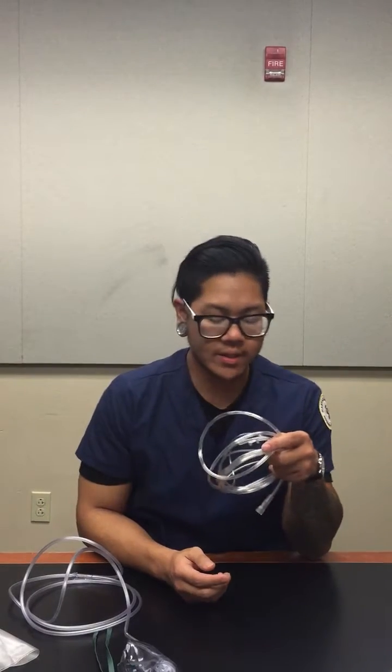The advantages for a nasal cannula are that you can use it on adults, children, and infants, and it's easy and cheap to use. The disadvantages are that it's uncomfortable, it's unstable, it can cause dryness and bleeding, and it can easily get dislodged out of your nostril. The best use for this is patients in stable condition who need low FiO2, and home care patients.